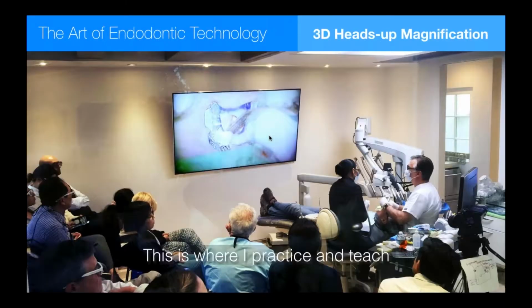So the next technology I'd like to explore with you is heads-up magnification. This is technology that comes out of neurosurgery and ophthalmic surgery. A company named TrueVision makes this, and I've been using it for the last 2 years. I honestly don't ever want to look in a microscope ocular again, because it requires me to be in an awkward position and in a very static situation for hours at a time when I'm doing long procedures.